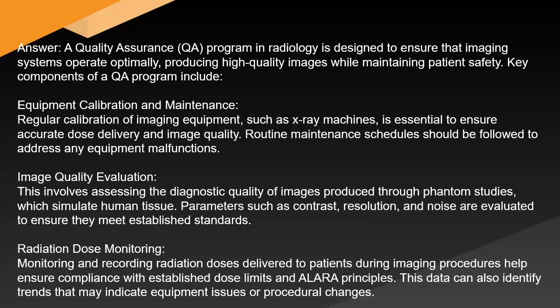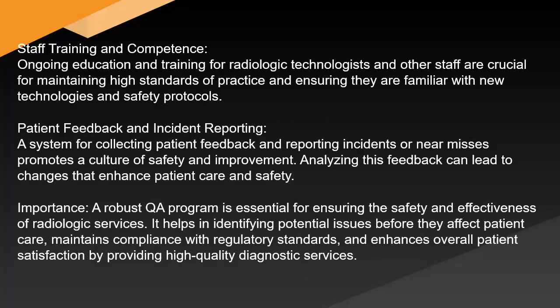Image quality evaluation. This involves assessing the diagnostic quality of images produced through phantom studies, which simulate human tissue. Parameters such as contrast, resolution, and noise are evaluated to ensure they meet established standards. Radiation dose monitoring. Monitoring and recording radiation doses delivered to patients during imaging procedures help ensure compliance with established dose limits and ALARA principles. This data can also identify trends that may indicate equipment issues or procedural changes. Staff training and competence. Ongoing education and training for radiologic technologists and other staff are crucial for maintaining high standards of practice and ensuring they are familiar with new technologies and safety protocols.